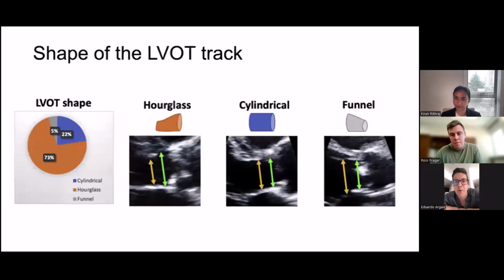This patient had a pulse pressure of 20. So how can you be certain this patient had a distributive shock with a VTI of 28 and a pulse pressure of 20? That made no sense to me. And of course, Corbin is here, and he would talk all about pulse pressure and the determinants of pulse pressure. But I would say pulse pressure can be increased because of things that have nothing to do with hemodynamics and have to do with stiffness of your arteries.